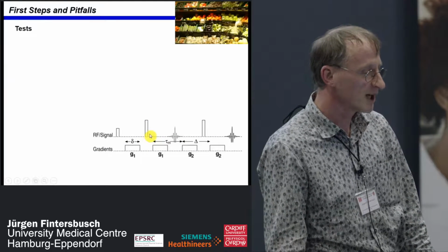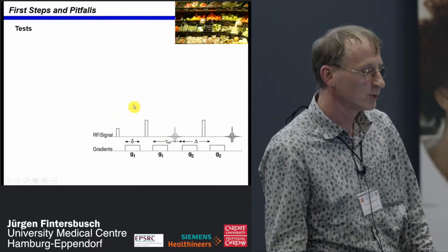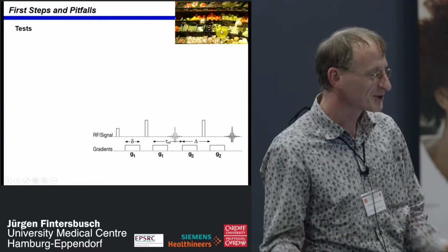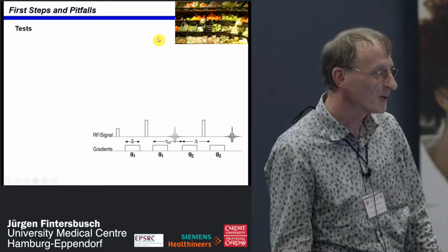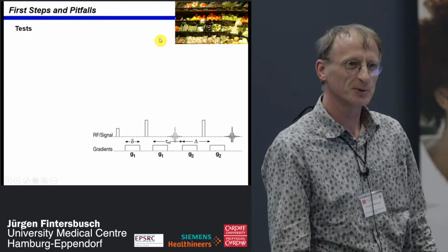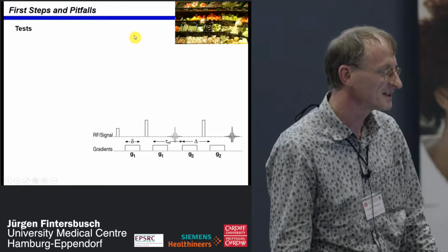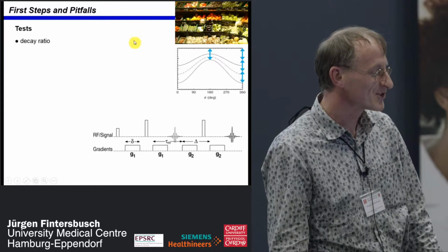So we became quite good customers of our local supermarket, which really has a fine selection of MR phantoms available. So this is a vegetarian corner, let's say. We found radish to be a quite good phantom. Some people say it's celery, but don't believe that. For some experiments, radish is also quite nice.